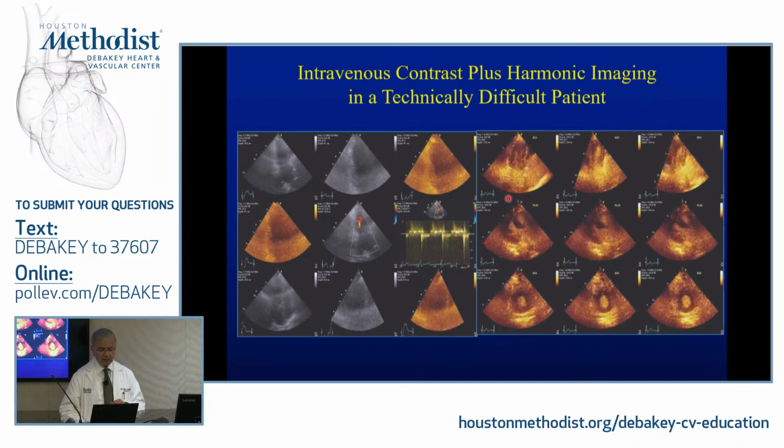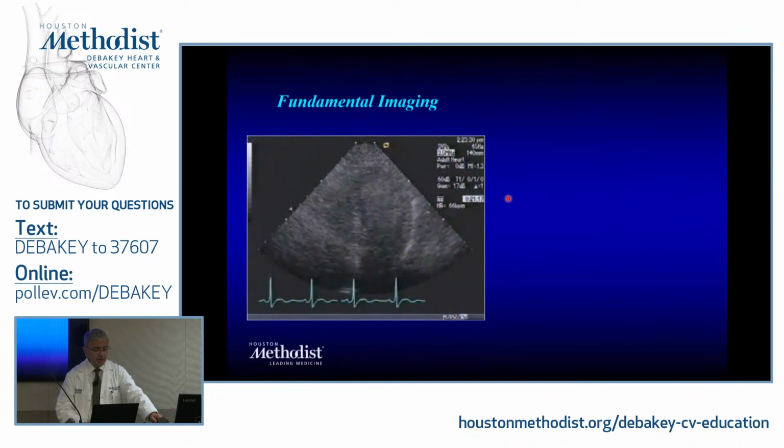And if you use contrast, the image is certainly much clearer, and I can see myocardium, I could see thickening, I could see ventricular size, I could see many other things. I wanted to share with you, and we'll have a special session on contrast a couple of weeks from now. But take a look. The image is not beautiful. This is contrast, but this is contrast with fundamental imaging.